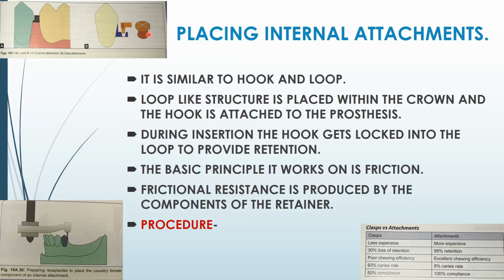Now during insertion, the hook gets locked into the loop to provide retention. It's like lock and key. The loop and hook get locked and provide retention. The basic principle it works on is friction, and the friction resistance is produced by the component of the retainers.